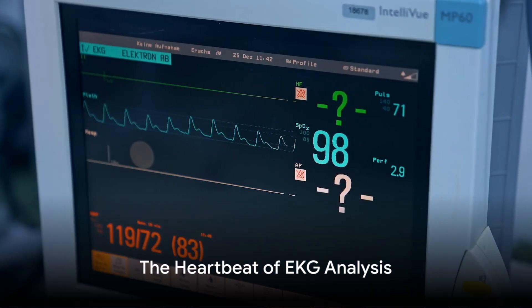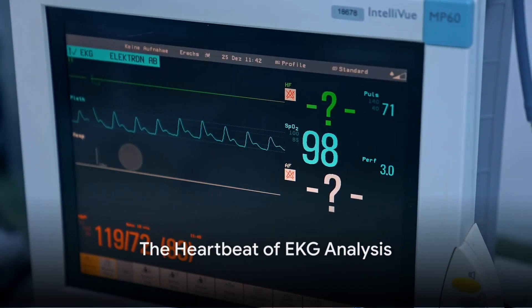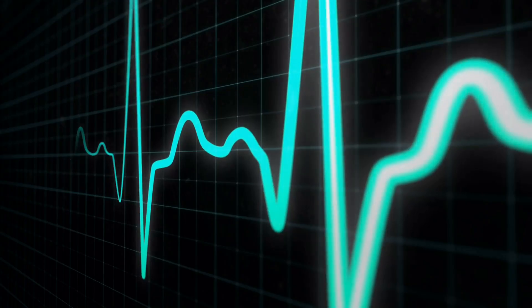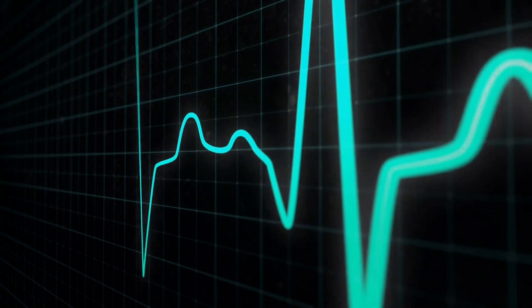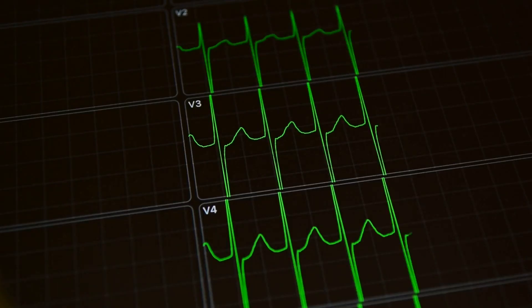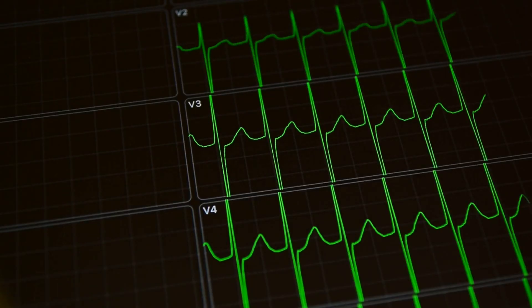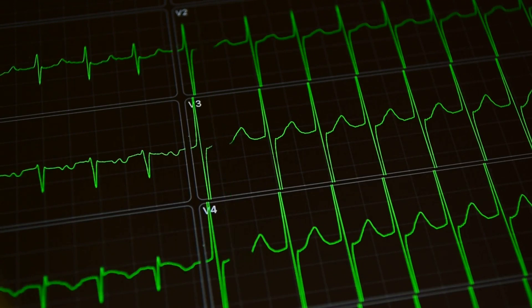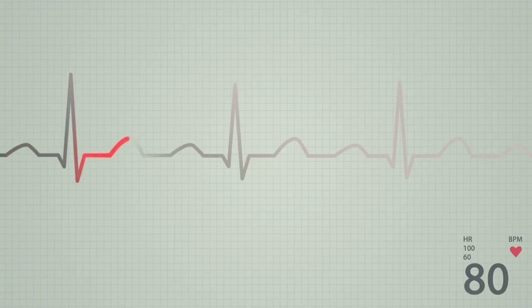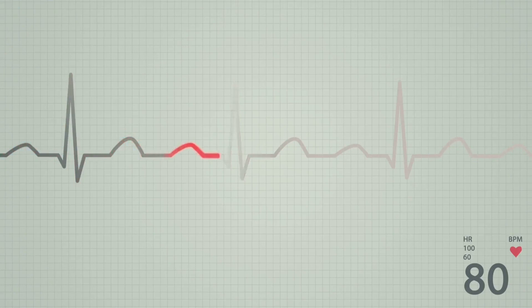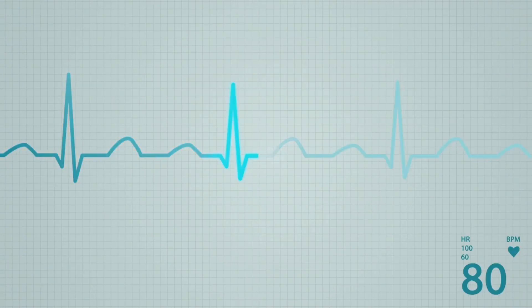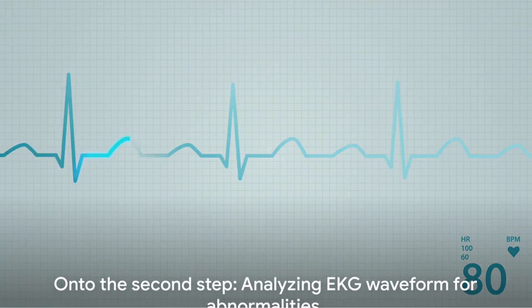First things first, what is the heart rate and is it regular? Determining the heart rate from an EKG strip is like finding the rhythm in a song. Each beat on the strip represents a heartbeat. Count the beats and you've got the rate. But is it regular? That's like asking, is the song playing to a steady beat or does it skip and vary? A regular rhythm is a sign of a healthy heart.